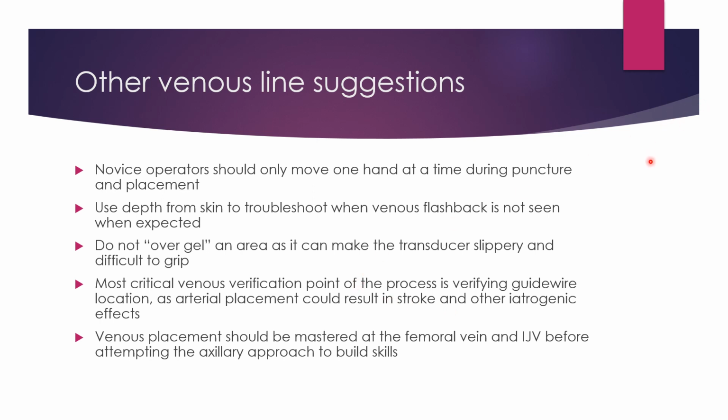Other venous line suggestions, this is just recommendations from people that have gotten involved in placing a lot of these. They say that novice operators should only move one hand at a time during a puncture and placement. So move your scan hand, then the needle, then your scan hand, catch up with the needle, and so on and so forth. And that limits your probability of missing the tip and penetrating something you didn't intend to penetrate.